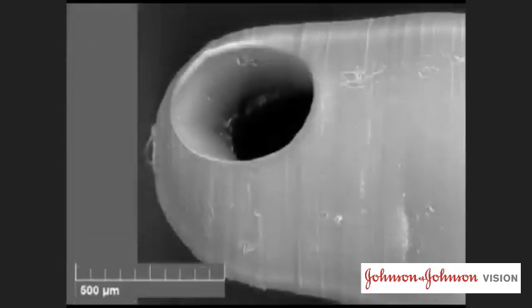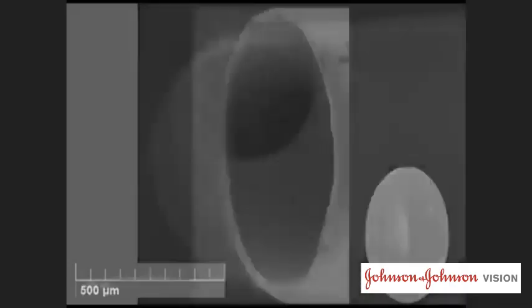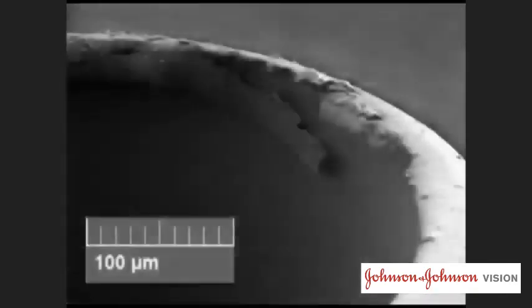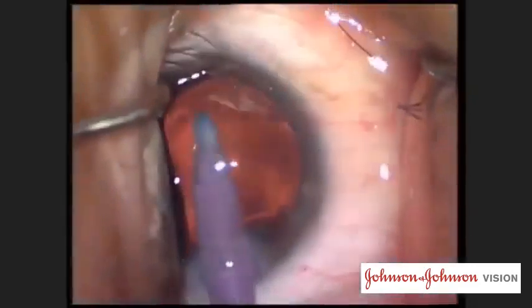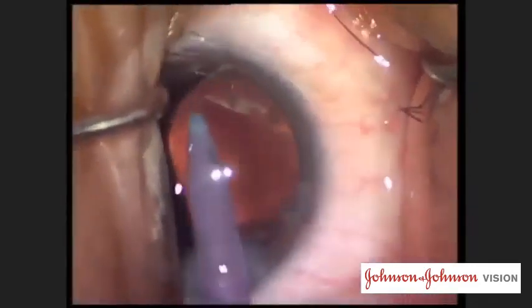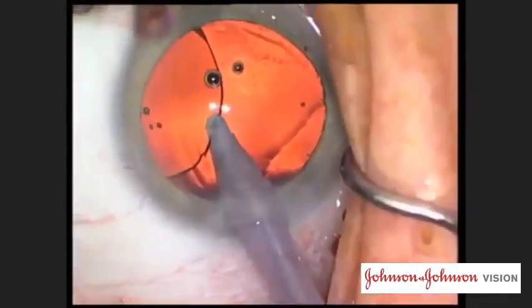Although no defect is apparent, a divot in the silicone sleeve can be seen just above the end of the inner metal tube. When the silicone sleeve was removed, significant burring in the opening of the metal tube is apparent. Sharp burrs in the end of the inner metal tube are the source of PCRs with this instrument. Contact between the posterior capsule and the burr can occur during aspiration, either through the aspiration port or through a tear.